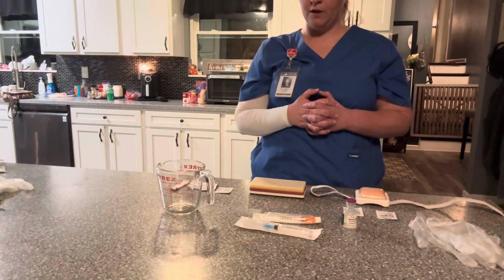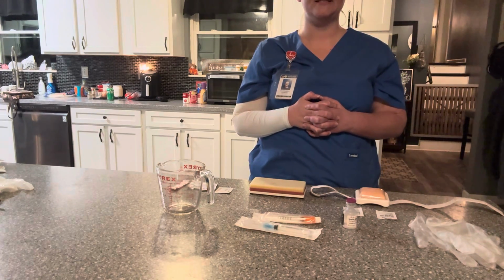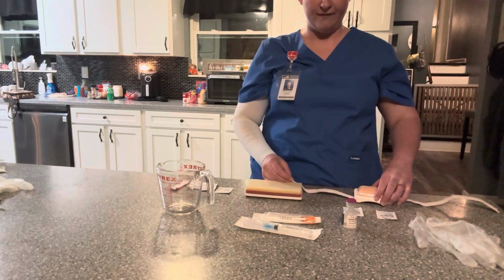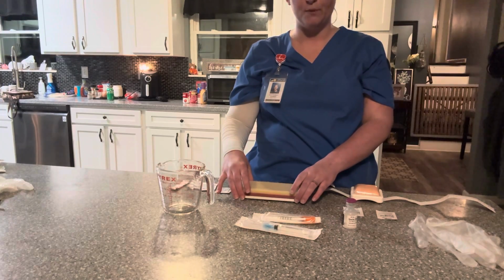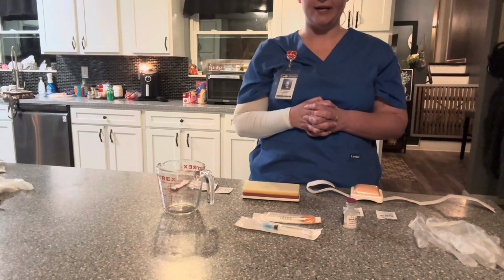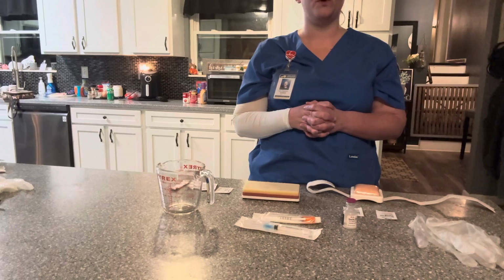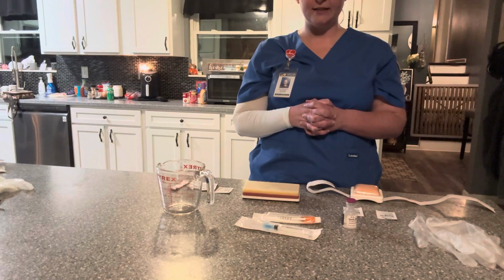And that is where I would give my subcutaneous injection. I will be demonstrating how to give my subcutaneous and intramuscular injection. For an intramuscular, I will give it in the deltoid, and for the subcutaneous, I will give it in the abdominal area. I would check my correct medication against the EMAR. I would use my general principles and safety practices.